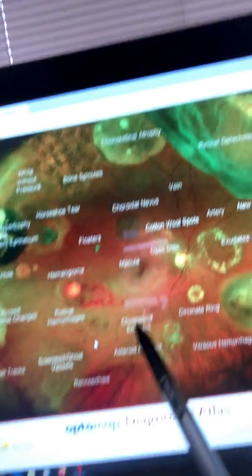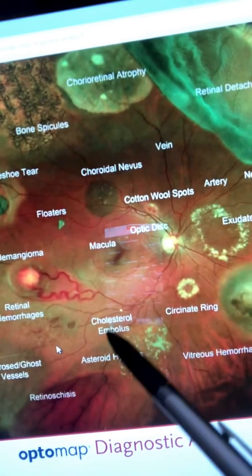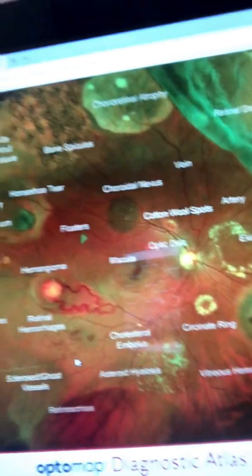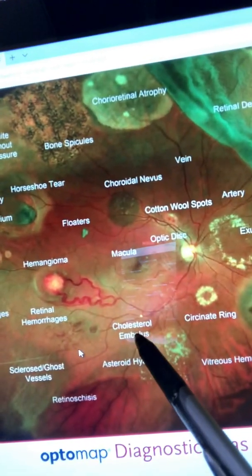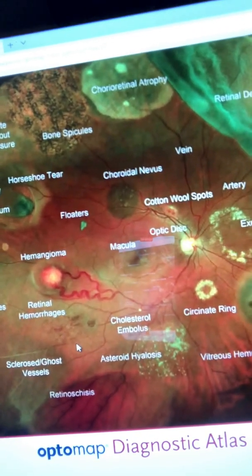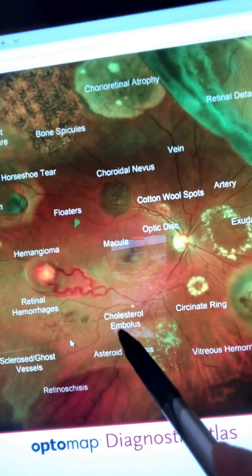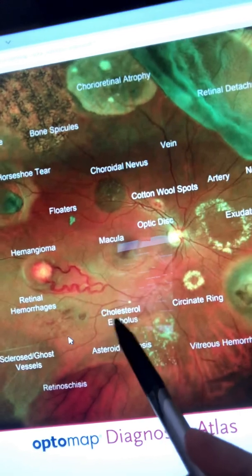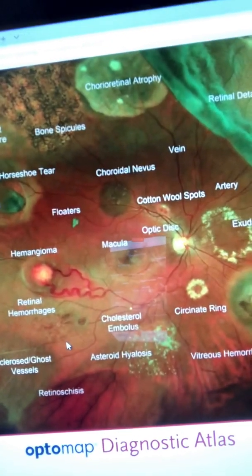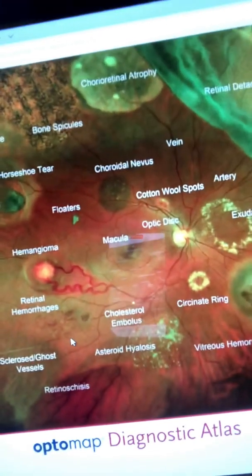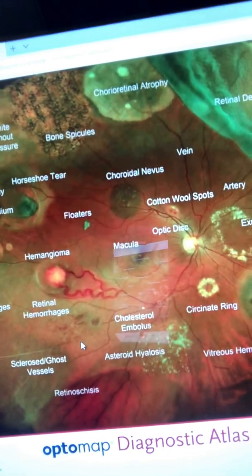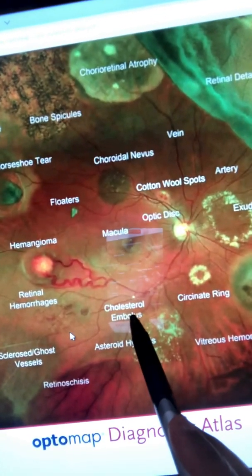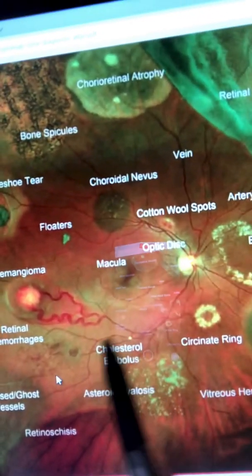If you look right there, this is a cholesterol embolus. It comes from a thrombus that turns into an embolus, and here in the retinal artery you can see that embolus, which can cause major sudden onset loss of vision. I see a lot of these, and this embolus can travel to the brain and cause a stroke. I have to send these patients for a complete stroke workup, carotid artery Doppler ultrasound of the neck, and possibly an endarterectomy. I get calls from the ER frequently thanking me for referring these patients.